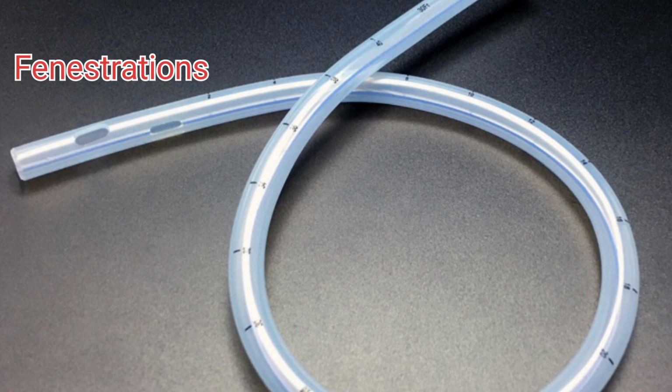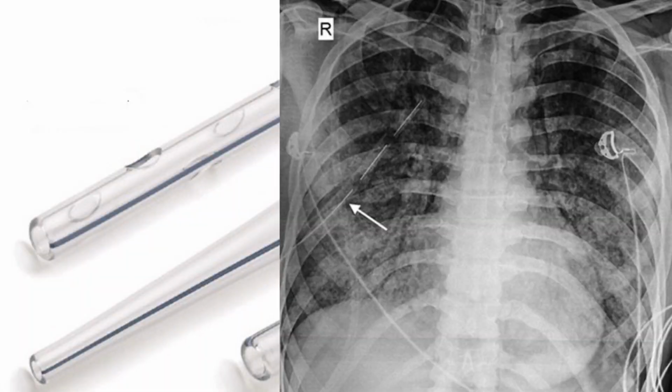The tube has few fenestrations or holes along the sides of the insertion end, which ease the rapid drainage and increase the dwell time. The tubes have a radio-opaque stripe which helps in the identification of the tube on chest X-ray.